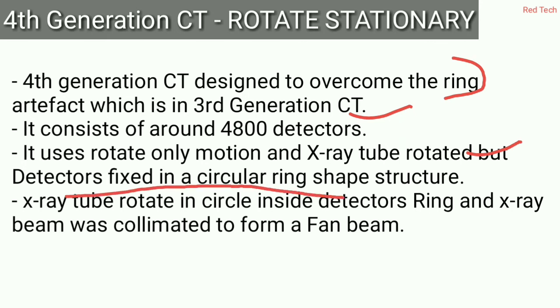It uses rotate-only motion, and the X-ray tube rotates, but all the detectors are fixed in a circular ring shaped structure. This means the 4,800 detectors are fixed in a circular ring, and only the X-ray tube is moving.